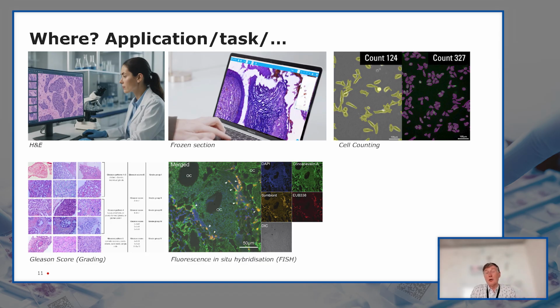But there are other use cases, besides the physical location, there are other locations where images are looked at. Think about frozen section. This is typically very much time driven. It is often done by a laptop. It's done often through collaboration tools, which is not that obvious.